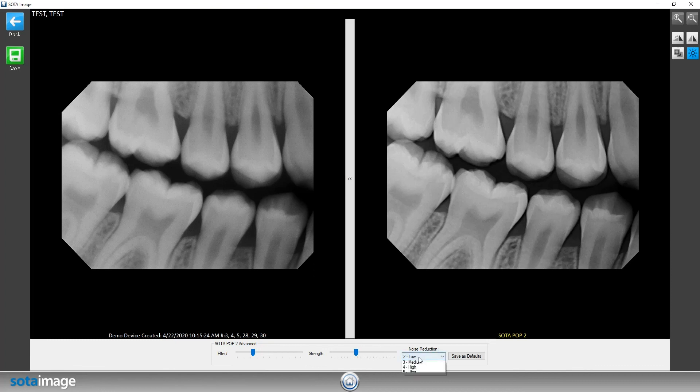For noise reduction, we do want to keep this at either low or medium. If you need to go to higher or ultra, that will depend on your actual x-ray tube and how strong it is. We do want to try to keep this as low as possible, because going into higher or ultra might have the adverse effect of actually blurring out the entire image, as it's trying to remove any of the graininess on the image itself.